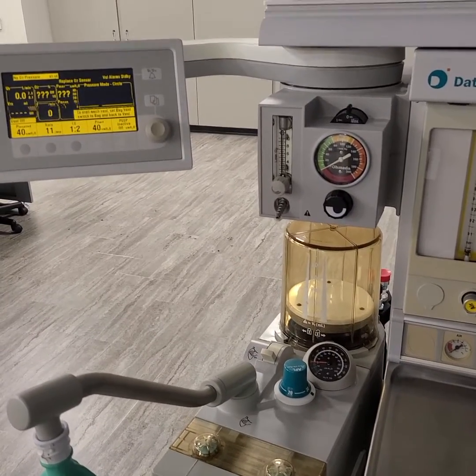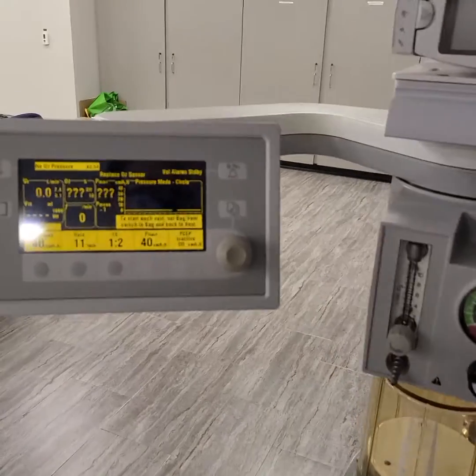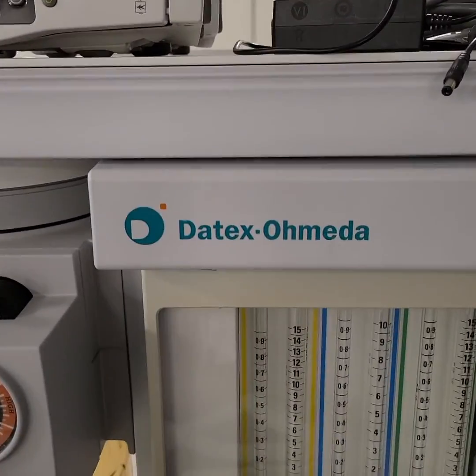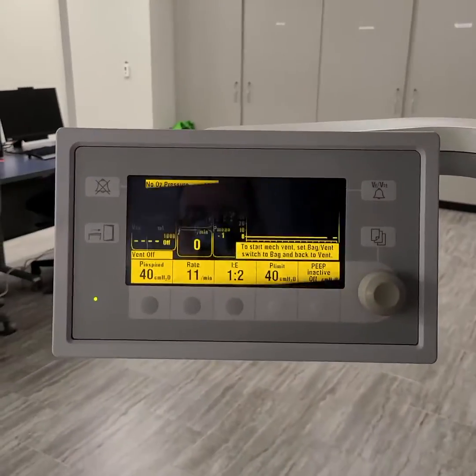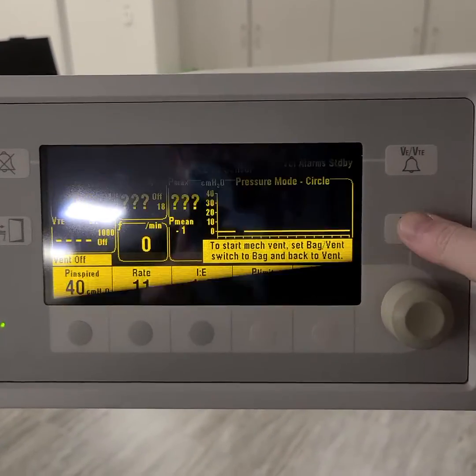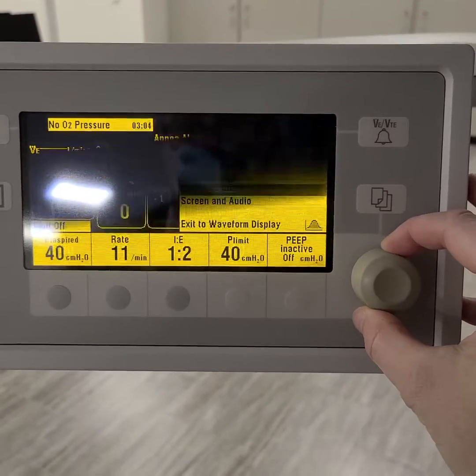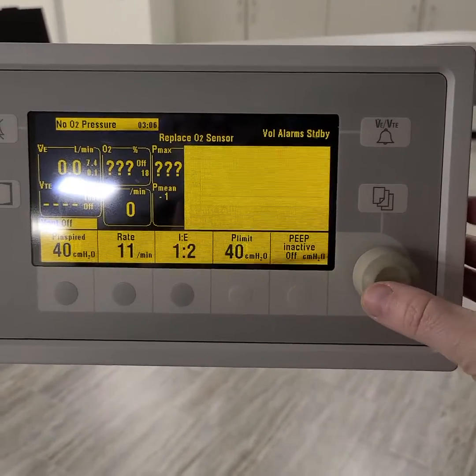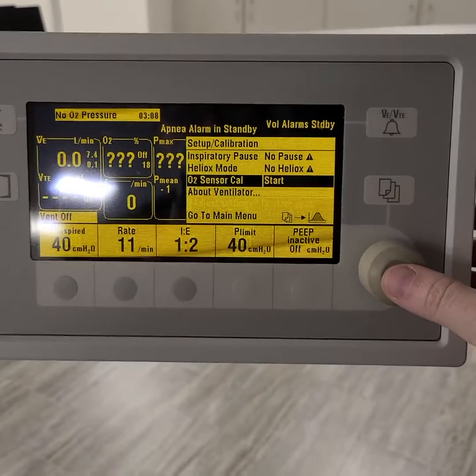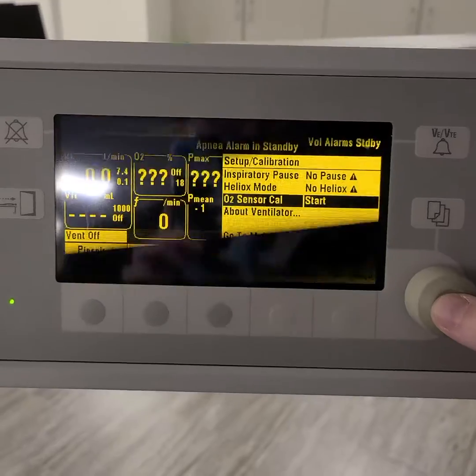This video is on how to calibrate the O2 sensor on the anesthesia machine. We are going to go ahead and go under our main settings, set up calibration, O2 sensor calibration.